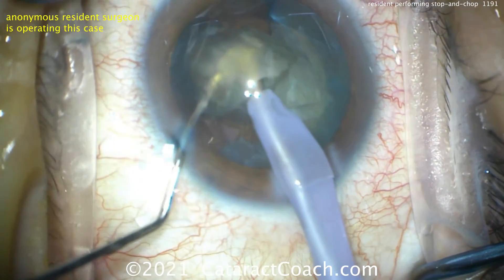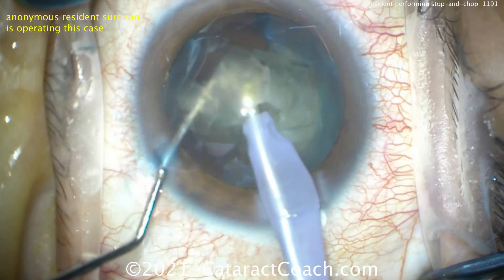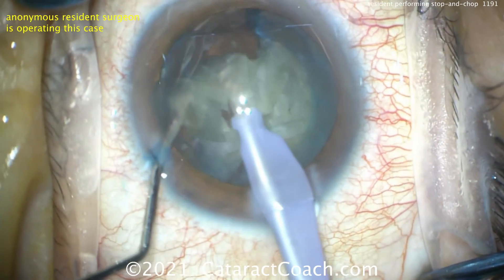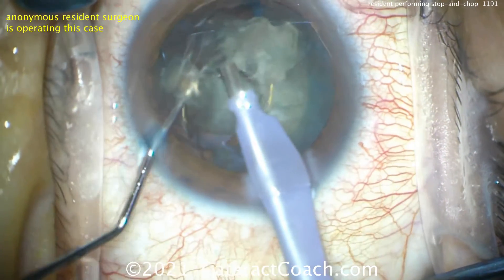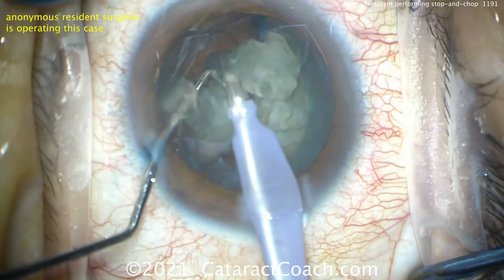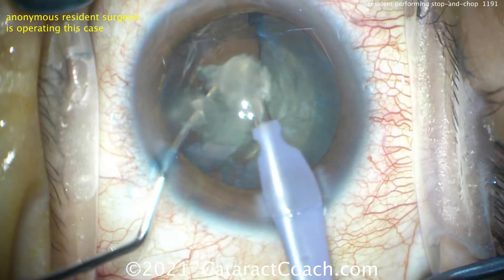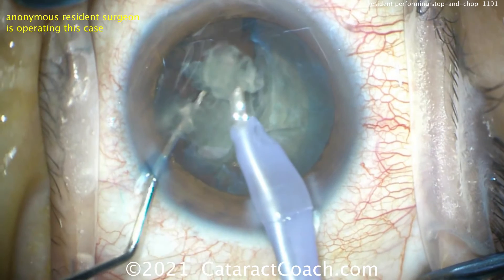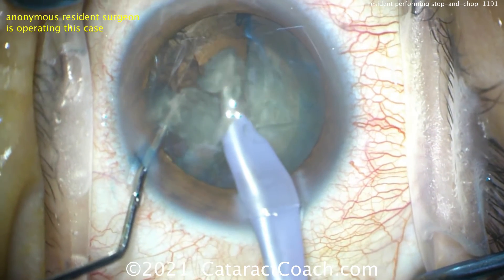There's the chop again — it splits. Beautiful. Notice the second heminucleus is still in the capsular bag. Ideally operating here closer to the iris plane and not close to the endothelium. I was present live for this surgery, and I can assure you that was the case. Now removing more of that nuclear piece — really nice how the eye stays in primary. He's pivoting well in the incisions.